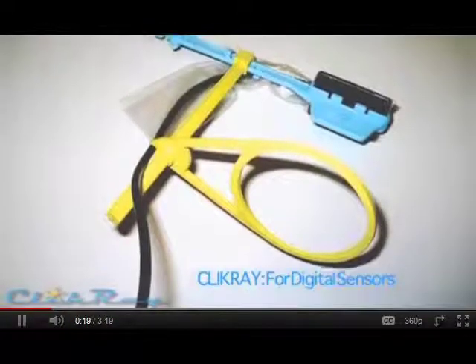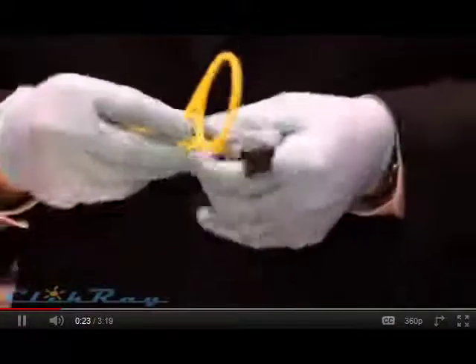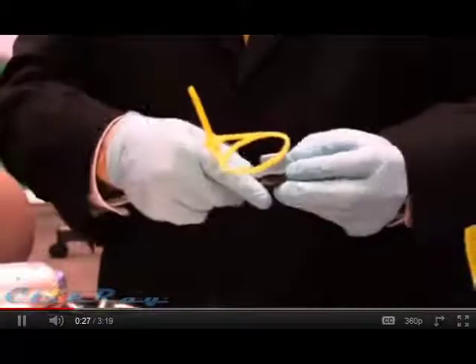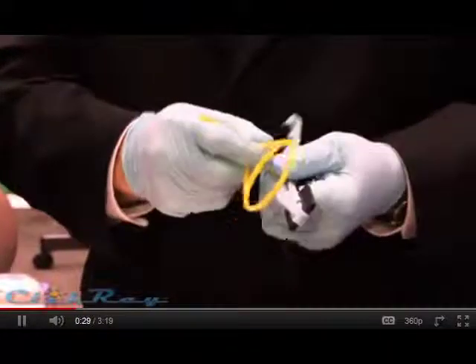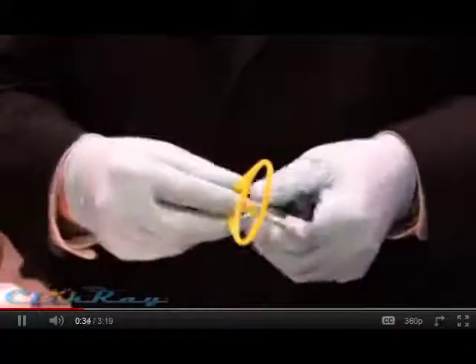This is used in conjunction with the ring. The ring has three positions — you can hear an audible click. In this case, the lower position for periapical, the middle position for the bite wing, and again an upper for the periapical.